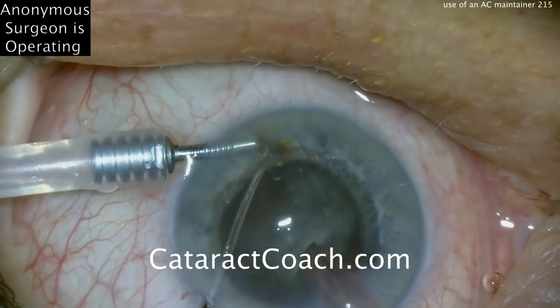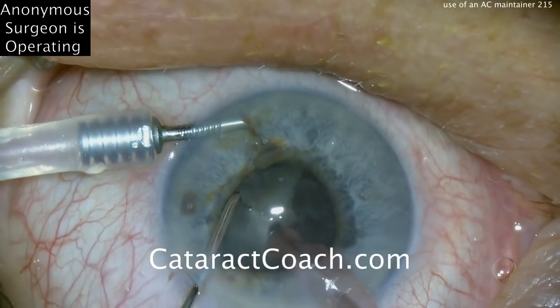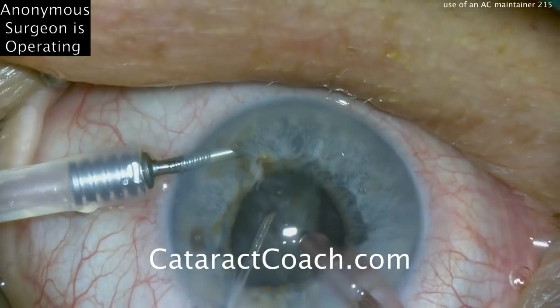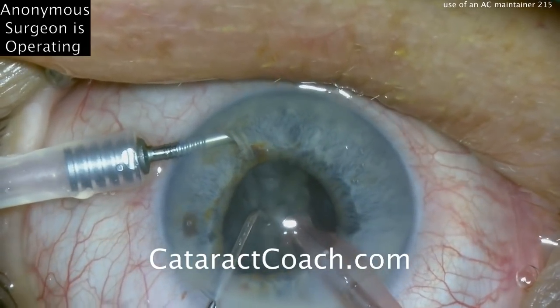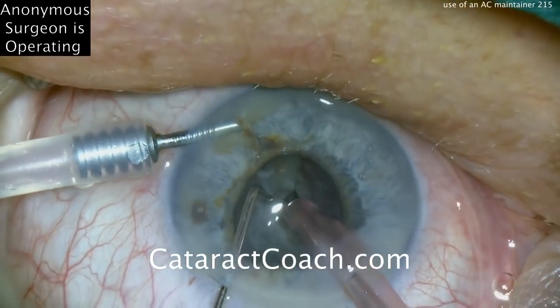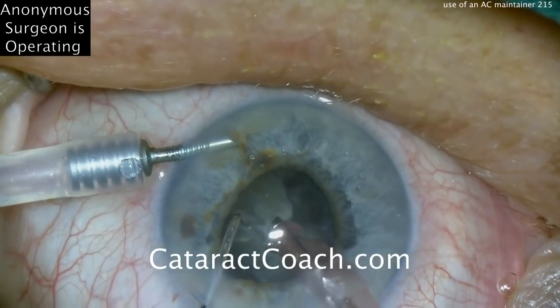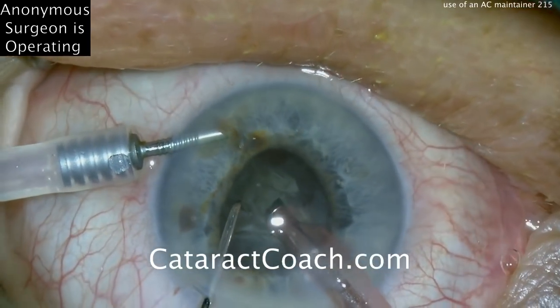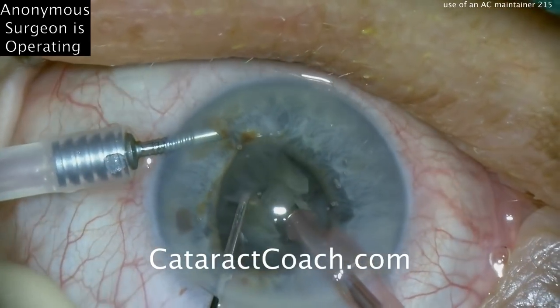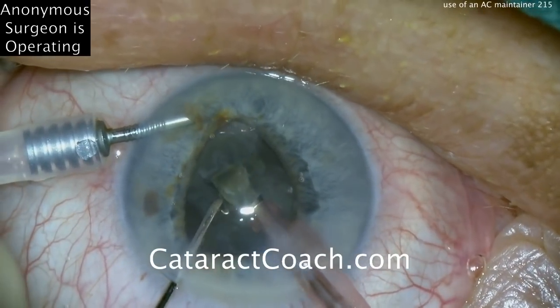Buzzing into the phaco probe, chopper on the equator — that's a pretty good attempt, but it didn't work because we lost vacuum. My advice would be to show more metal on the phaco tip. If we have more metal on the phaco tip, it allows us to embed the phaco probe deeper into the nuclear piece, meaning a tighter hold, more vacuum, and easier to chop. When there's so little of the phaco tip showing, you can only embed it less than a millimeter, making it difficult to hold pieces with high vacuum. Remember, you won't be able to embed further than where the silicone sleeve is. Show a little more metal on the phaco tip — we have a previous video on CataractCoach showing exactly how to adjust the phaco tip and IA tip for maximum performance.